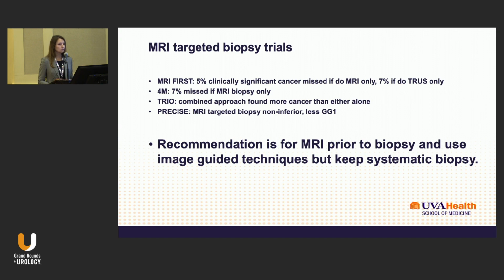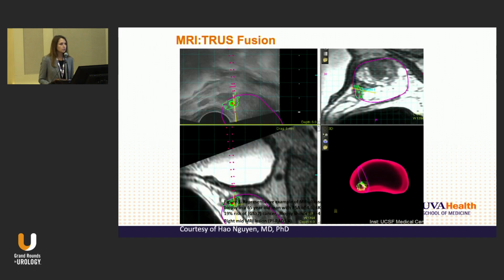And so keep in mind that the MRI is only as good as the equipment as well as the person who's reading it. So this is MRI fusion, just a good picture to look at. And of course, I think this is widespread now.